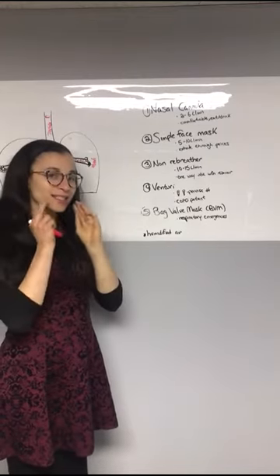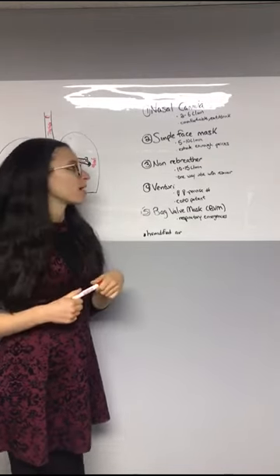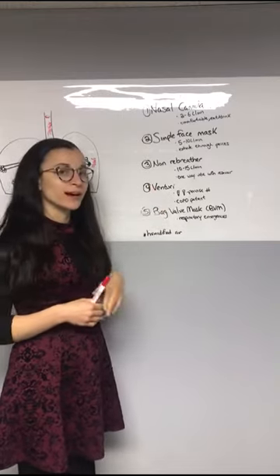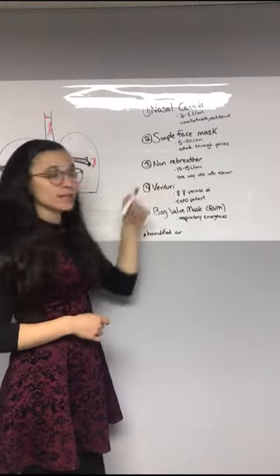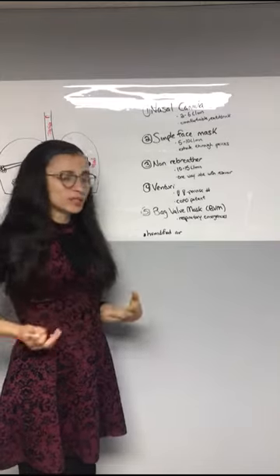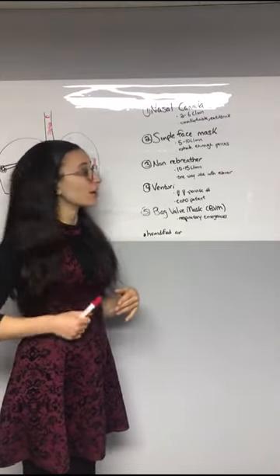And there's little pieces that when the patient exhales, it goes out through there. If you have a patient that's hypoxic, you're not gonna go from the nasal cannula and then work your way down. If someone's turning blue and they're hypoxic, you're gonna jump to something like this. You're not gonna go 1, 2, 3. The nasal cannula is for someone very stable, talking to you, perfect. They just have a little bit lower oxygen. You like to see them a little higher.